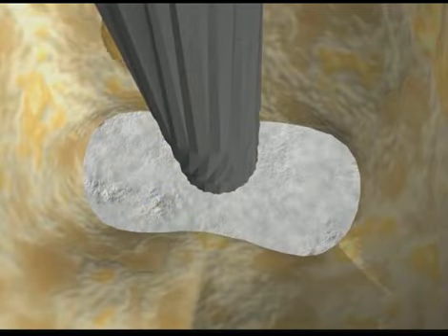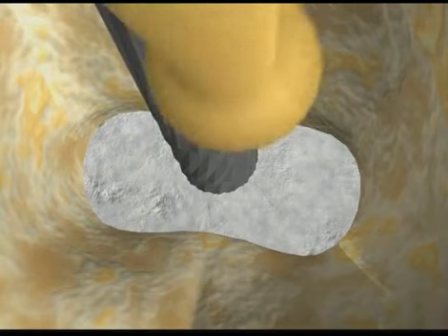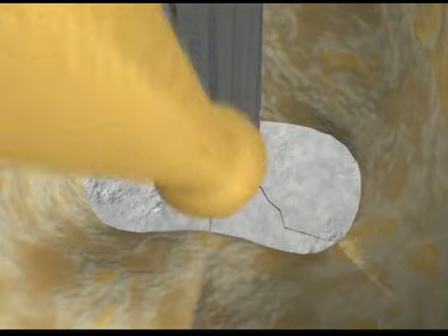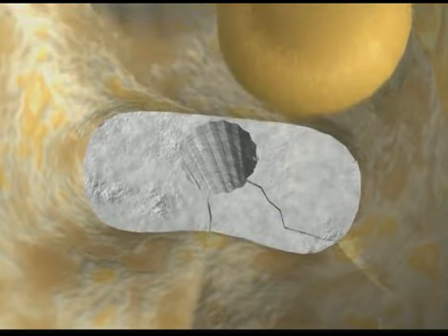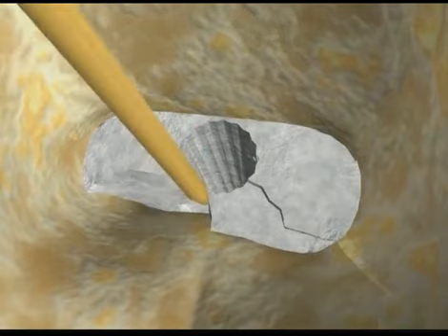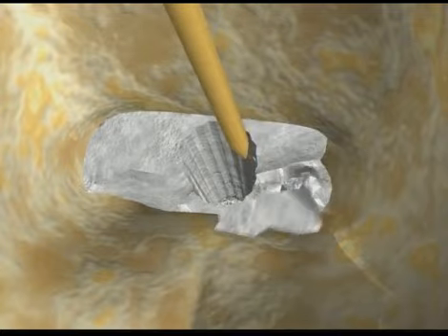We are now looking at the occlusal view. The energized Endo 1 tip continues to vibrate against the post. We can now observe fracture lines in the cement and the initiation of post-bond failure. Following post-removal, an appropriately sized ultrasonic instrument may be utilized to remove circumferential restorative materials.